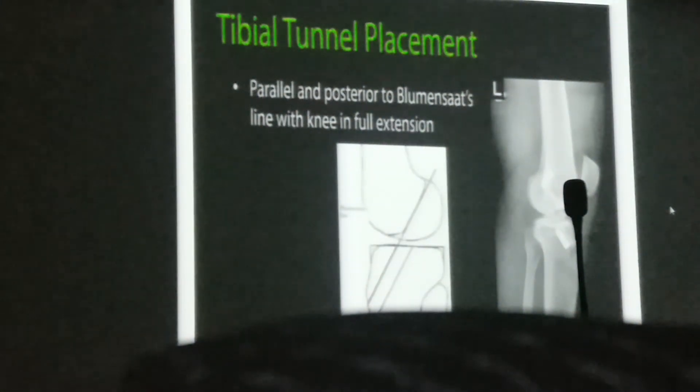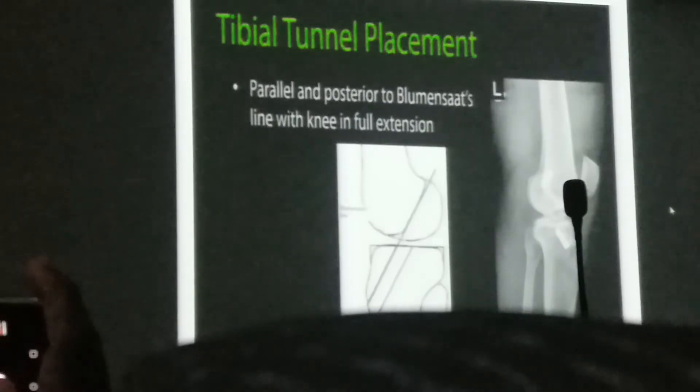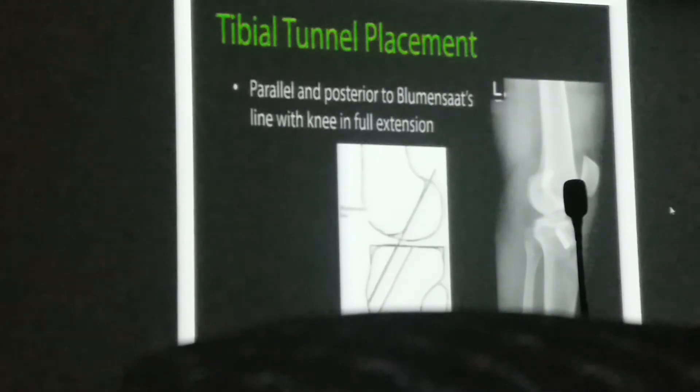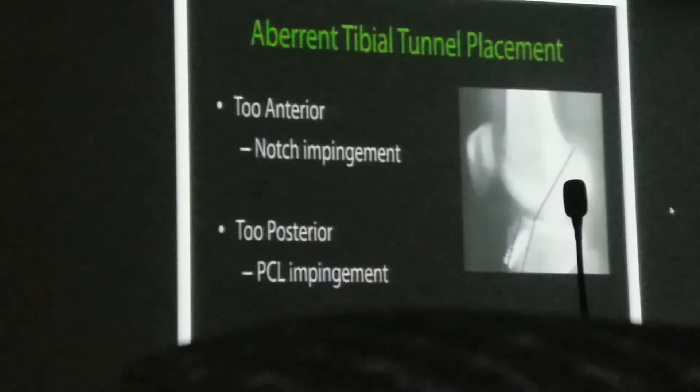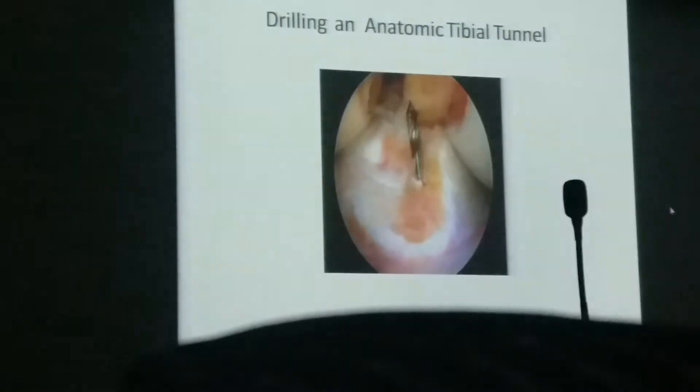Once the tibial tunnel is drilled, verify with X-ray or C-arm: the tibial tunnel should be posterior and parallel to Blumensaat's line. Anterior tunnel placement impinges the notch; posterior placement impinges the PCL. Notchplasty may be required to avoid impingement, and it can also facilitate accurate tibial-femoral tunnel placement. The ideal tibial entry point is 1 to 2 mm anterior to the posterior border of the anterior horn of the lateral meniscus and 1 to 2 mm medial to the tibial midline.